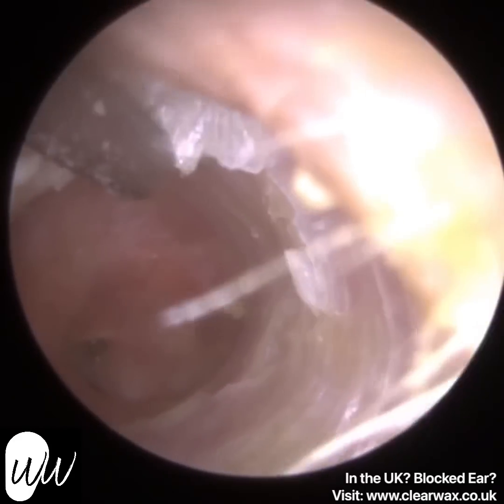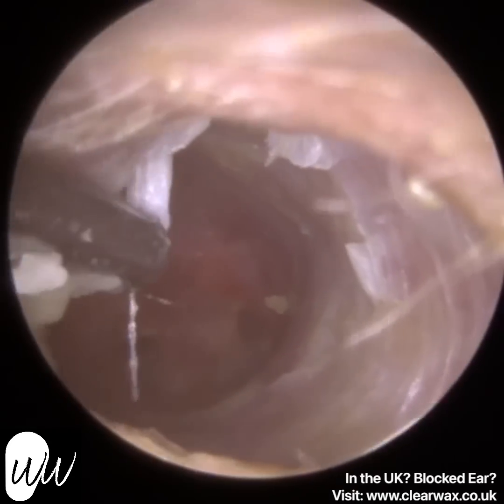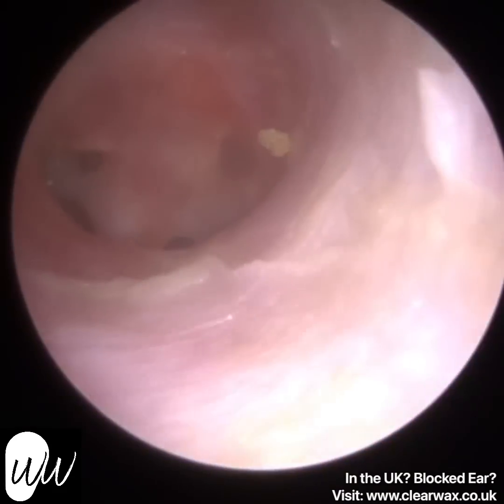And if you stay tuned, the right ear, in fact, is a lot narrower. There was a lot more traditional, should I say, earwax in that ear. And as I mentioned a moment ago, they have got a very acute otitis media.